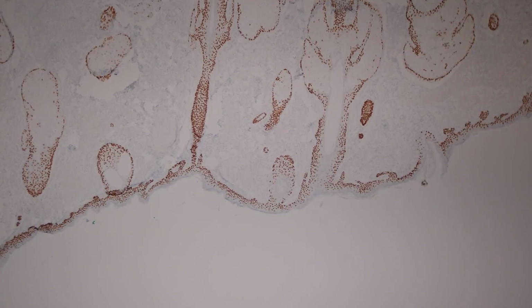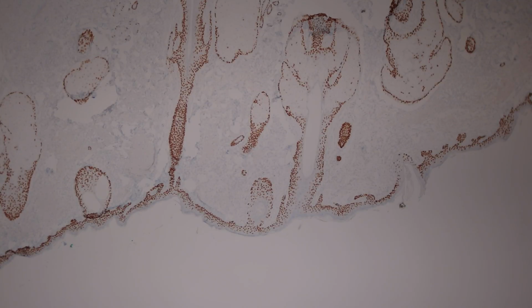So p63 and its closely related stain p40, which is basically an isoform of p63, stain many of the epithelial structures, actually most of the epithelial structures in the skin. And they're really useful because basal cell carcinoma, squamous cell carcinoma, and a wide variety of adnexal tumors, both benign and malignant, will express p63 and p40. So it's one of the most common stains that I actually use in my practice as a dermatopathologist. So that's p63.